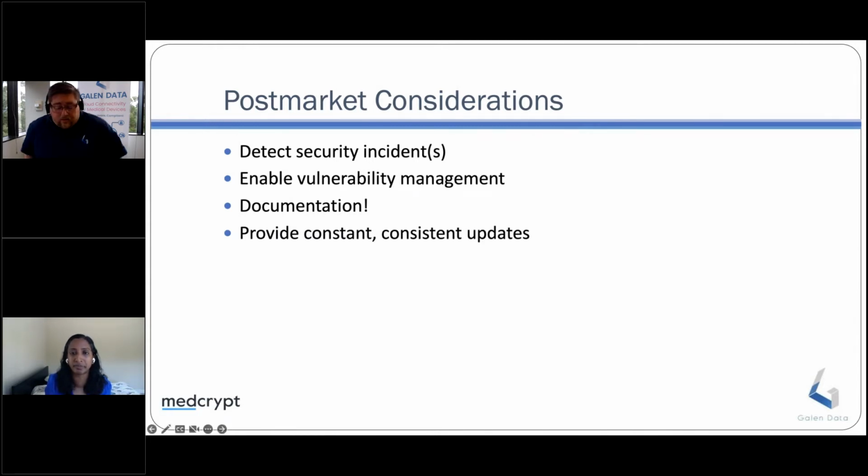Yeah, I agree. Being able to see those logs timely and being able to have some sort of centralized detection of just when something went wrong is really critical to monitoring those devices. Now, to be clear, we're talking about hospital devices in hospitals or in homes. We're not talking about class 3 implantables.